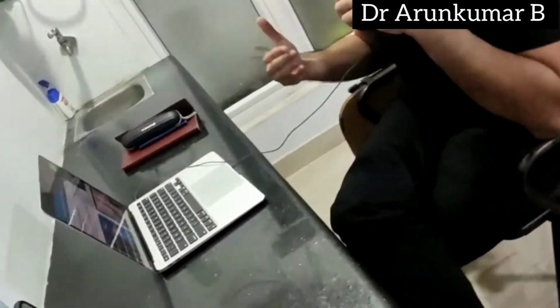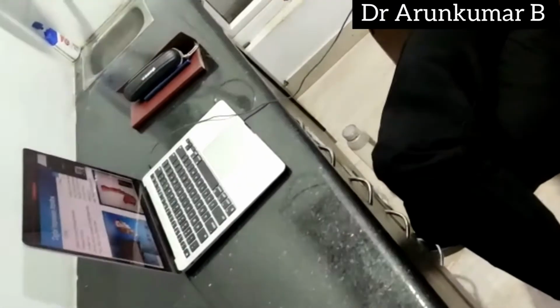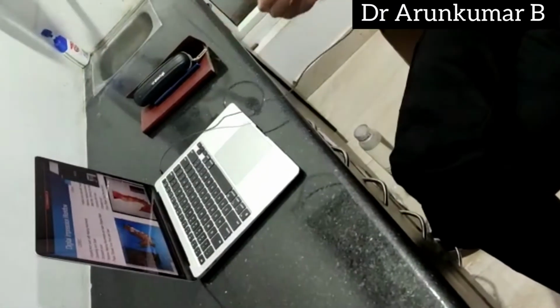Whichever arch that we have placed that implant, we first scan that particular arch and we start the scan with the healing abutment in place. So we do the implant arch scan with the healing abutment in place. The purpose of gingival mask scan is to have the ideal emergence that is required for us to give.